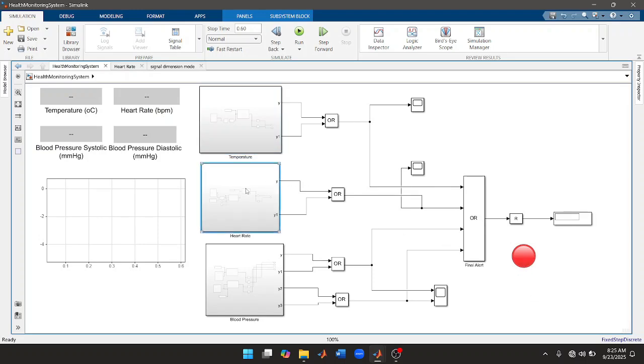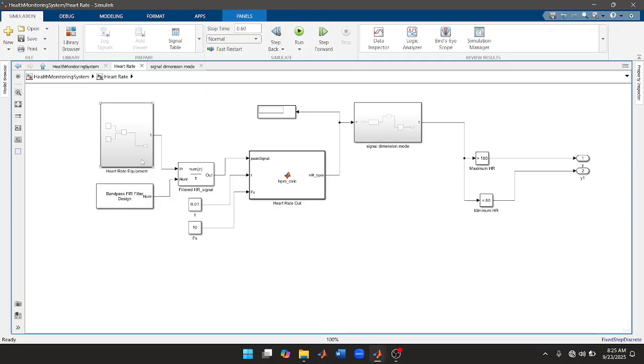Now, for the heart rate, this is the heart rate measuring equipment. The heart rate of a person is normally between 60 and 100. So within 60 to 100, it's going to be normal. Above 100, the machine is going to output a very dangerous signal saying that the person is in danger. Below 60 is still an alert that the patient is in danger.